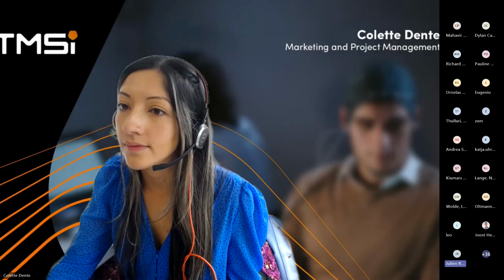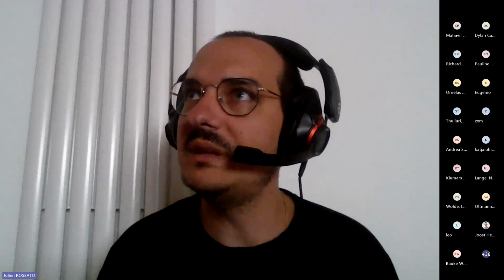So it's a great question. So the manual editing, first, I will say that it's highly reliable across operators. We already published a paper on this. It's a paper of François Hugues and collaborators in 2021 in the Journal of Electromyography and Kinesiology. And so how much time it takes, I would say it depends on your results. But basically, I would say for 20 motor units, you can have between 5 and 10 minutes of editing. More like 5, I would say.